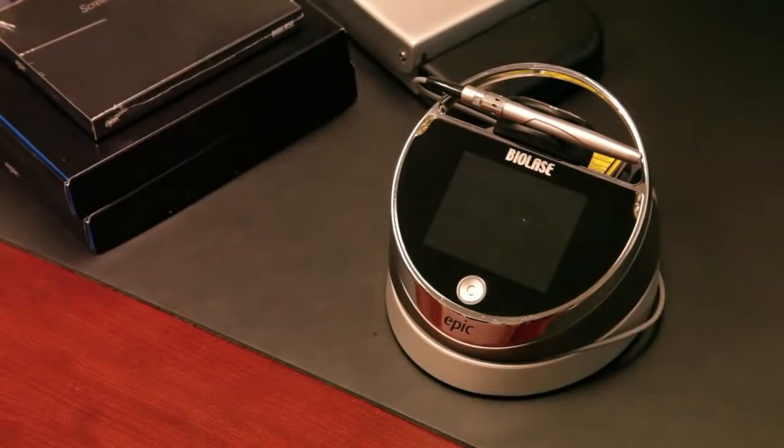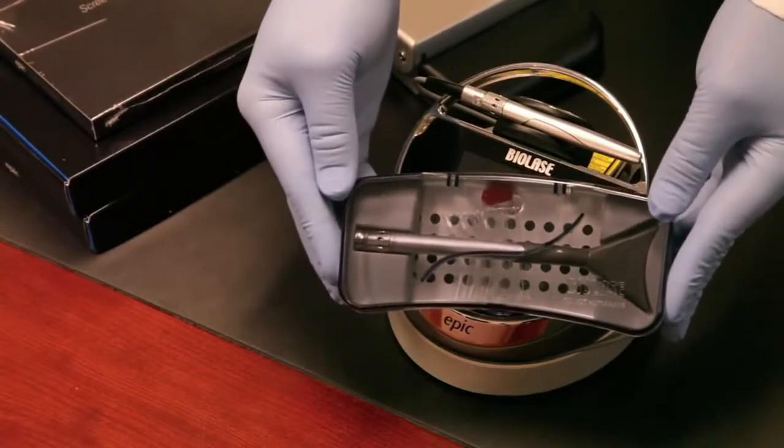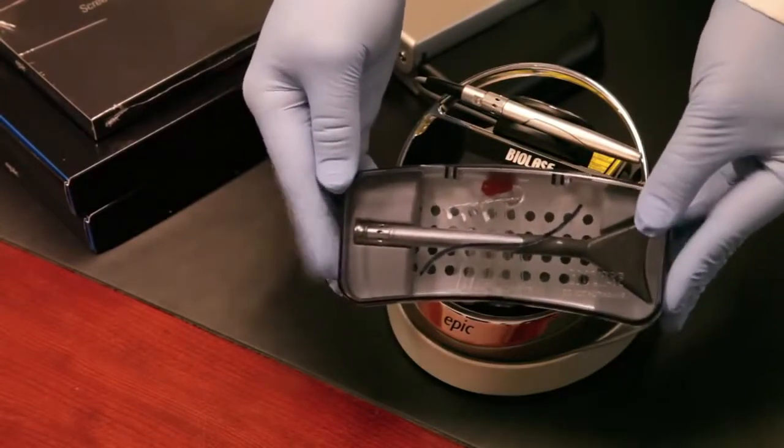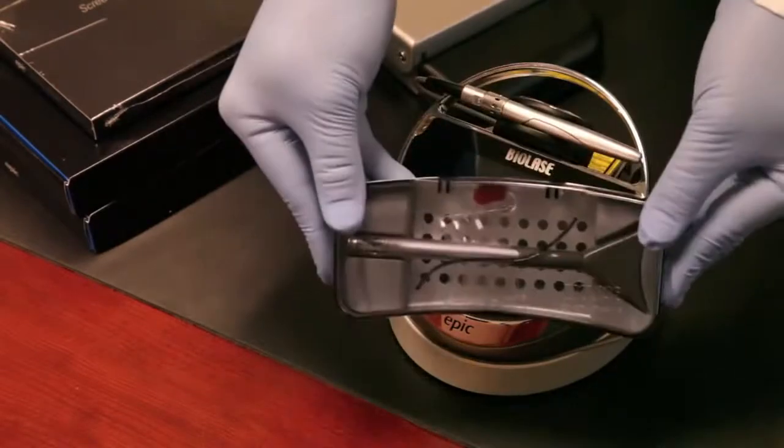If you order our whitening package, you will also receive in addition to the two handpieces a whitening handpiece. It looks just like this and will attach to the handpiece. We'll show this in a few minutes as well, what it looks like and how it works for performing tooth whitening with your Epic laser.